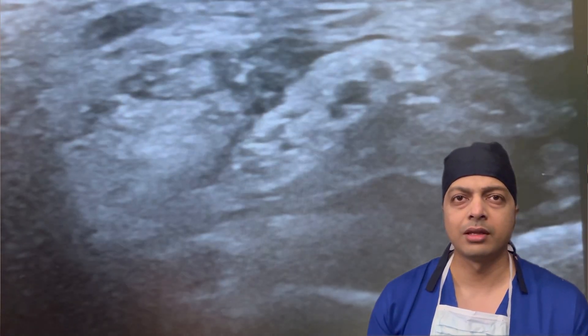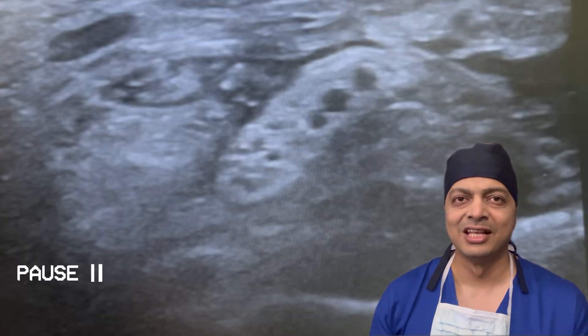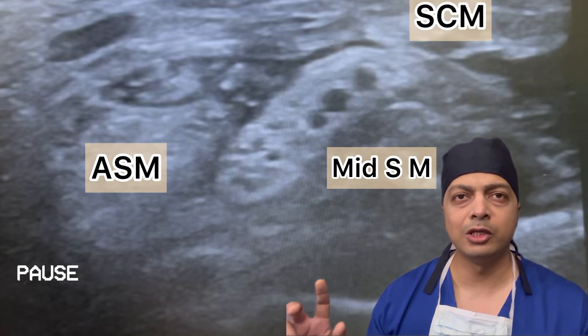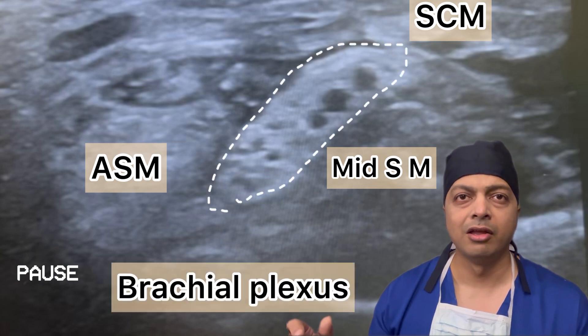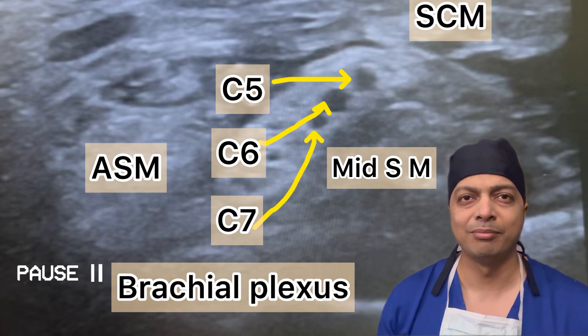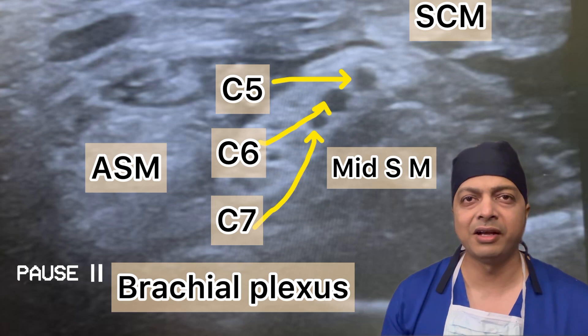Here I will show you the structures pierced by the needle to enter the interscalene space to reach the roots of the brachial plexus, and how the injection is delivered around the brachial plexus in the interscalene area. So quickly, let me tell you about the anatomy by pausing the video. Here you can see the anterior scalene muscle, the middle scalene muscle, and in between those muscles you will find the interscalene area where the brachial plexus is lying. On top of it you will see the C5 and C6 root, and below that the C7 root. These three — C5, C6, C7 — are nicely displayed in this ultrasound image.